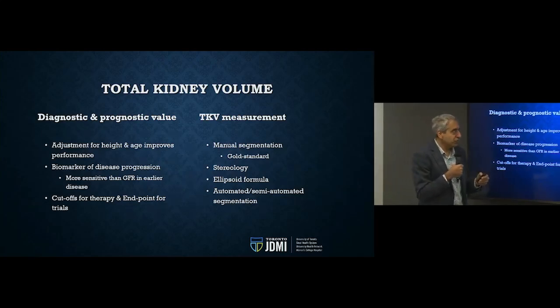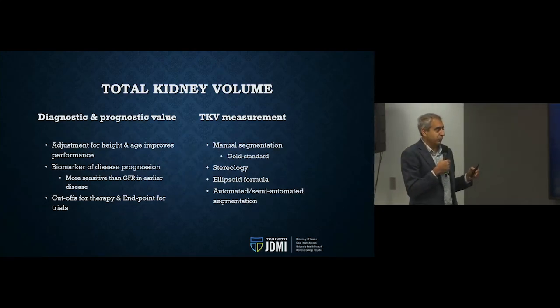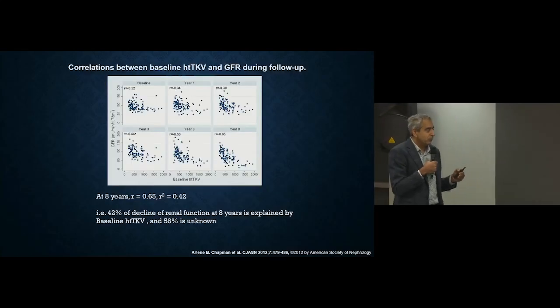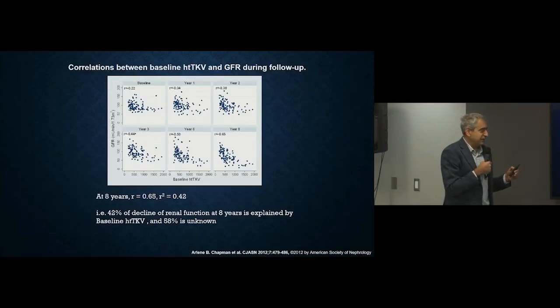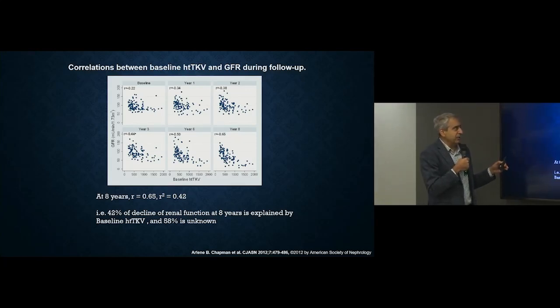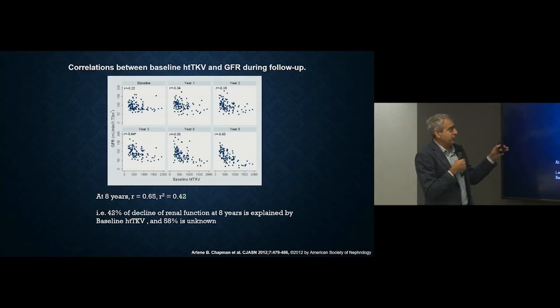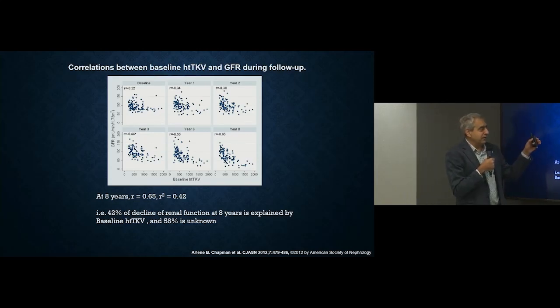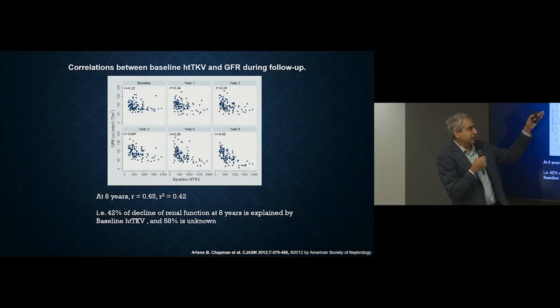So how do we measure the total kidney volume? There are different methods that I'm going to go through now. But before I do that, this is a classical slide from an excellent study that came out about 10 years ago or so. And here, just to emphasize the role of total kidney volume, this is height-adjusted TKV.